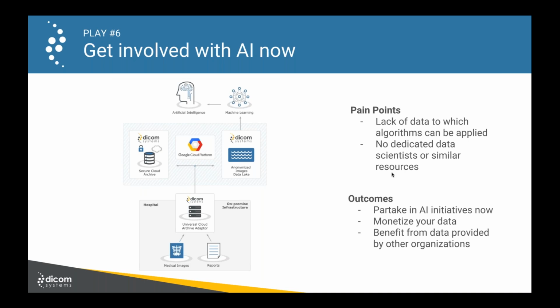Then they brought in a third-party auditor to ensure that the algorithm we created for them, first of all, did the job that they requested, and second of all, did not introduce any kind of vulnerability or violate any safe harbor rules. Once they felt that this algorithm was safe, they placed it into production, and they started de-identifying the 2 million exams, and everybody's happy.